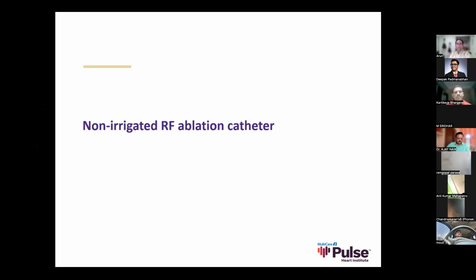There are some ways to predict what the tissue temperature is going to be, but the absolute way to know the tissue temperature is to use a thermal camera. You need to actually use a thermal camera to see the tissue temperature and the depth. It can only be done in experimental situations. You have to have a direct field of view to use a thermal camera. You can't use it inside the human body. So we have some limitations. There are some newer ways where they use ultrasound technologies to monitor tissue temperature, but those are all experimental.